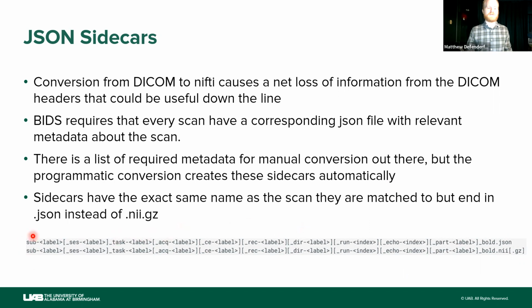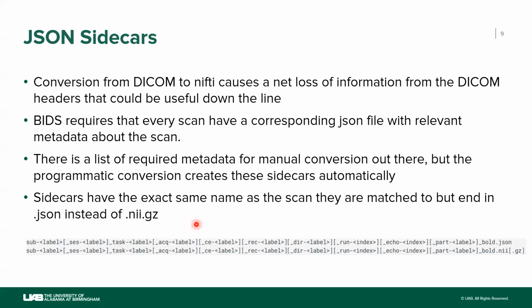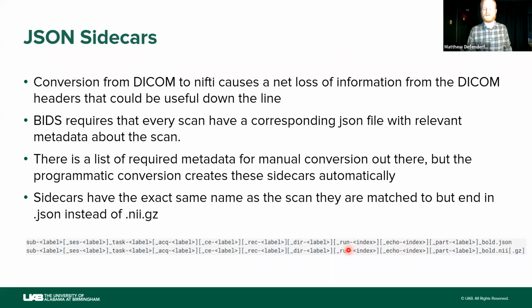So for these bold files, it has to have the subject and the subject name, as well as the task key and a specific label for the task. So everything else here is optional.